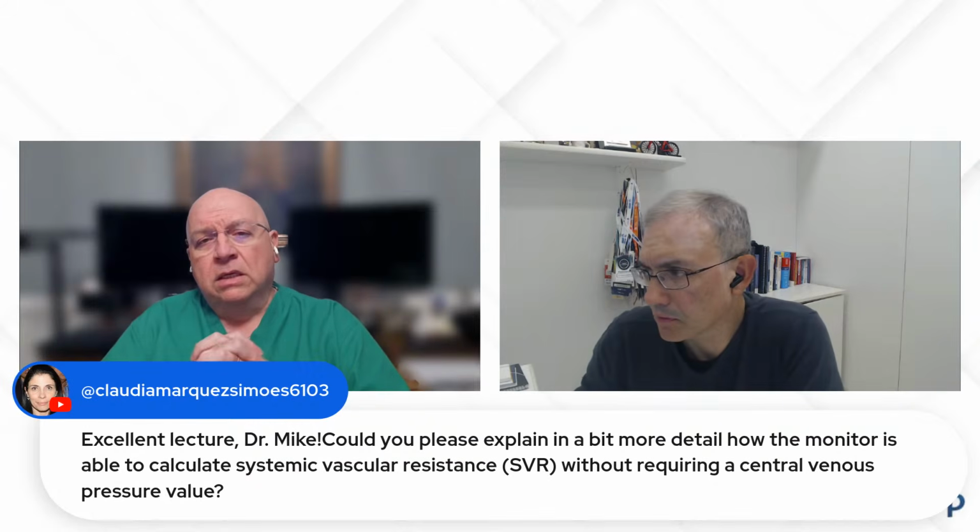But what I have found is that as a trend monitor, it is very, very good at gauging systemic vascular resistance. One of the cases that I think highlights that very well is the patients that I take care of for liver transplant that come in with ascites. We were talking about this before the lecture started.